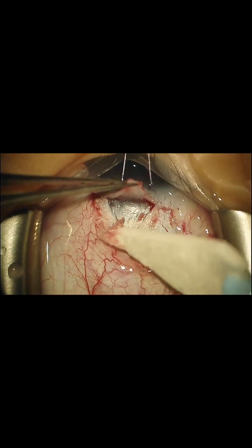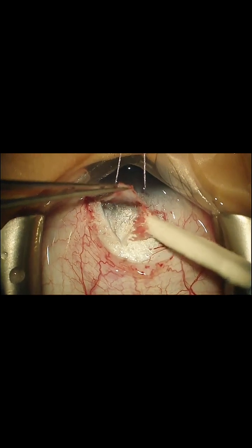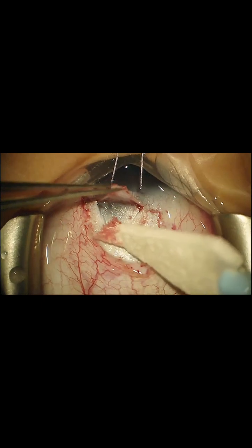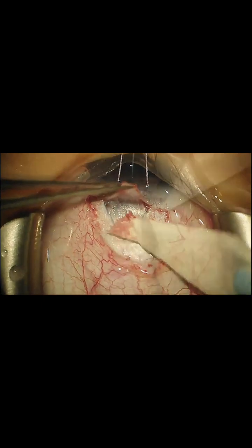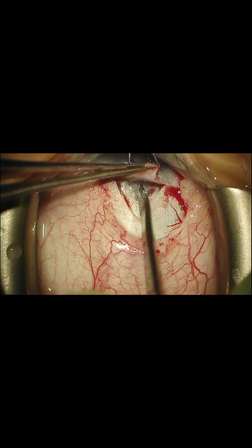In this eye, since it's so stretched out, there's not a real super distinct blue-white junction, but it's about right here. I'm going to do about a 2 millimeter radial incision just anterior to where these little draining vessels are.